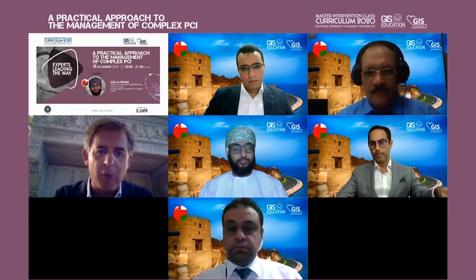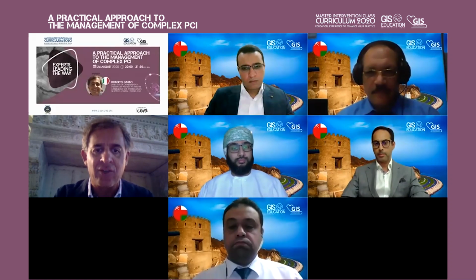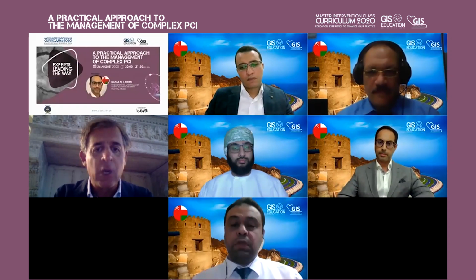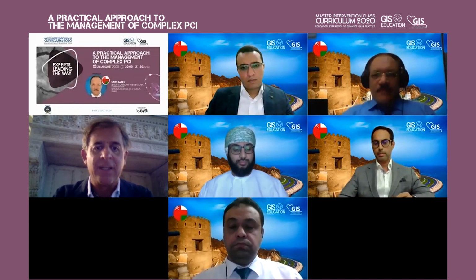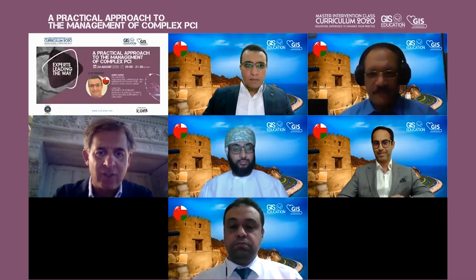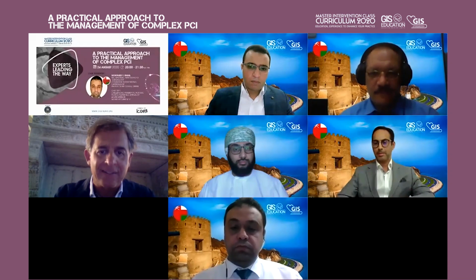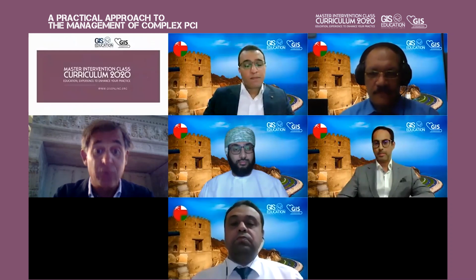I agree. The second problem is the injection of contrast, because probably the pressure was damping, and the operator made an injection and caused the dissection. The third point is very important: once you have a dissection, you must not inject contrast again, because many operators think they want to see more. But if your guiding catheter made a dissection in the left main and you inject, you increase the space of your subintimal dissection.